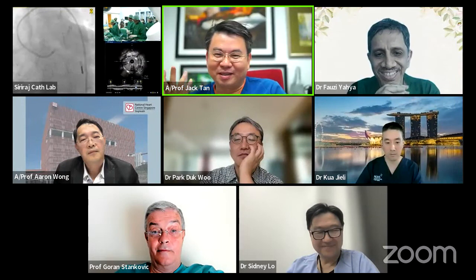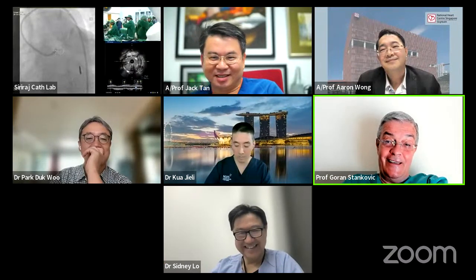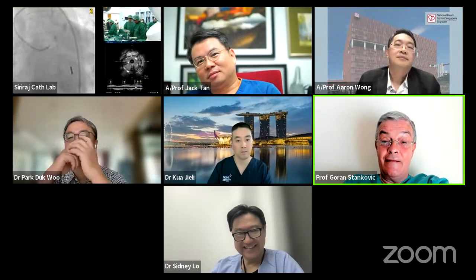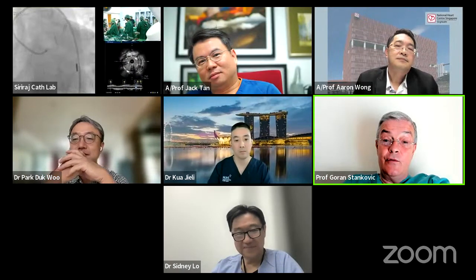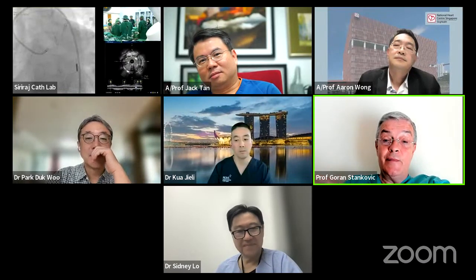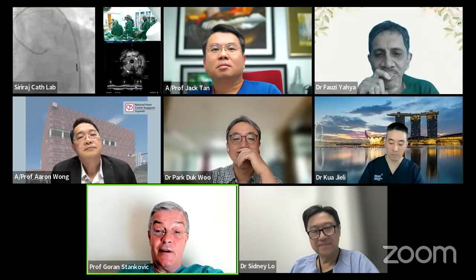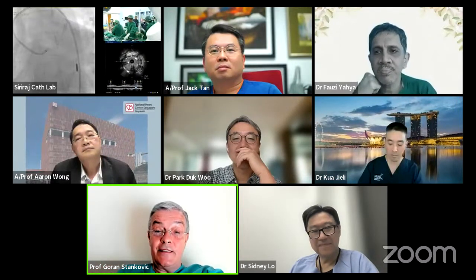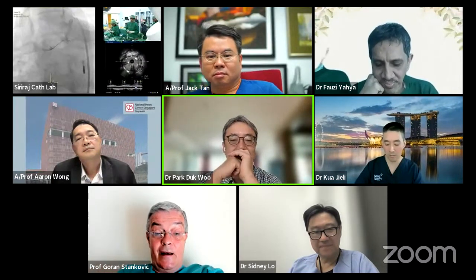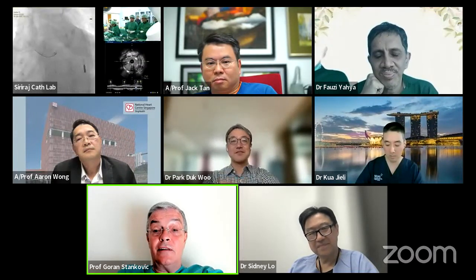Okay, so again, very strong message there. Goran, last point, then we have to go back. I have to play the role of devil's advocate in this case, because if you read the literature and British Cardiovascular Intervention Society data, in 2014 they used 50% IVUS and OCT for left main PCI, and they clearly showed the benefit, even after that, regarding hard endpoints compared to angio guidance. And then they increased to 70%, with clear evidence from the registry that there is a benefit. But overall, in BCIS, use of imaging is in the range of 10 to 13%.